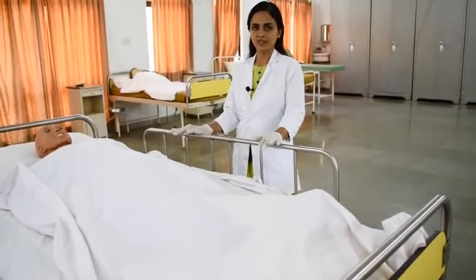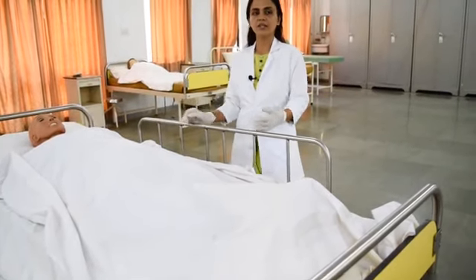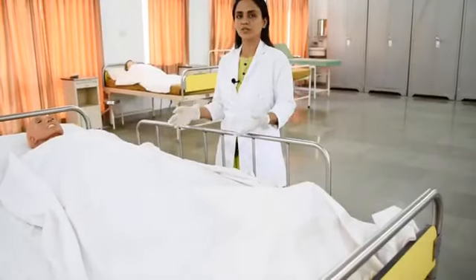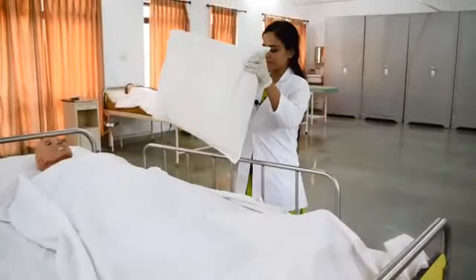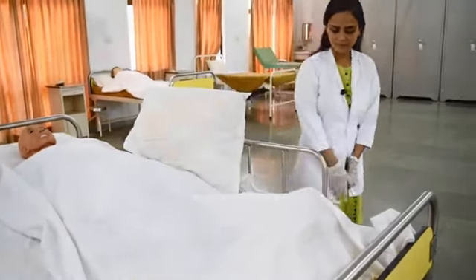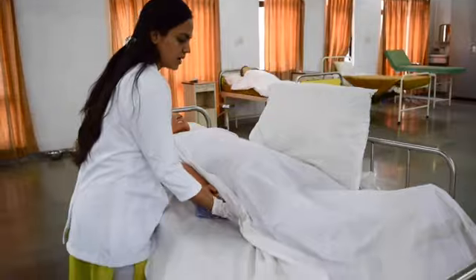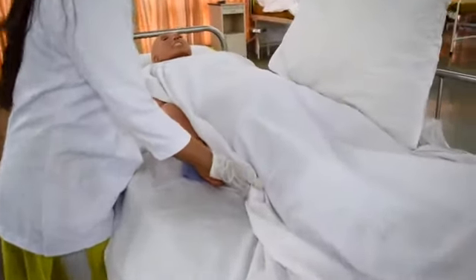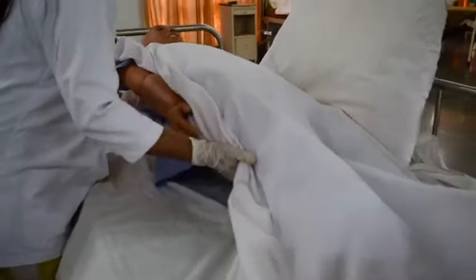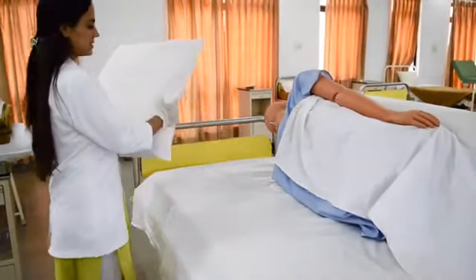If no assistance is available, then we have to keep this railing up. Otherwise, we can call somebody to hold the patient here so that the patient doesn't fall down. Place a pillow here like this. We have to place the hands like this under the thigh and under the back. Then we have to turn the patient to that side. Then take this pillow and place it aside.